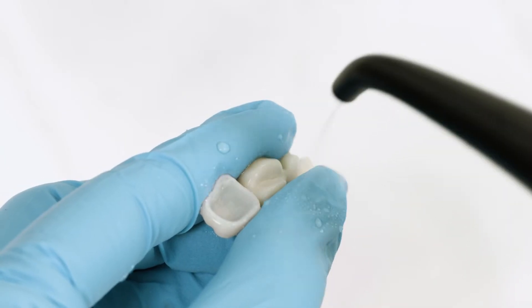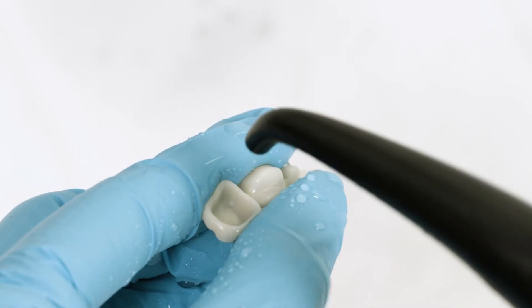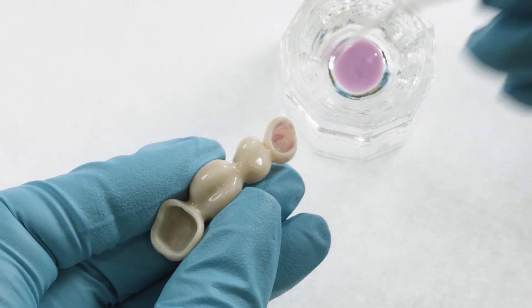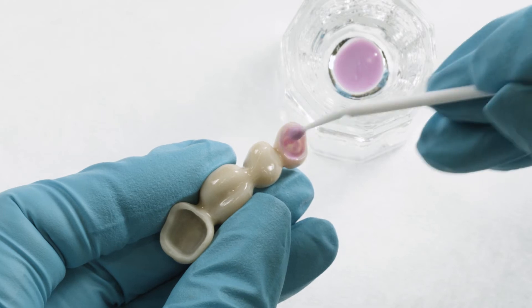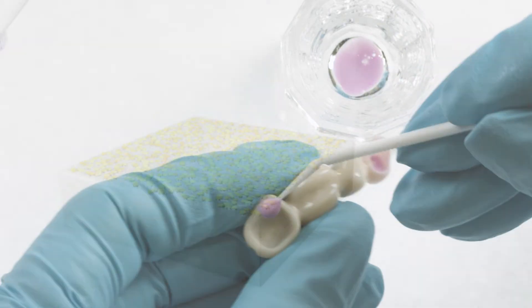Here is how to clean a contaminated restoration surface with IvoClean. After the try-in, thoroughly rinse the restoration with water spray and dry with oil-free air. Then cover the entire bonding surface of the restoration with a layer of IvoClean using an applicator. Allow 20 seconds for the cleaning action of IvoClean to take effect on the bonding surface.